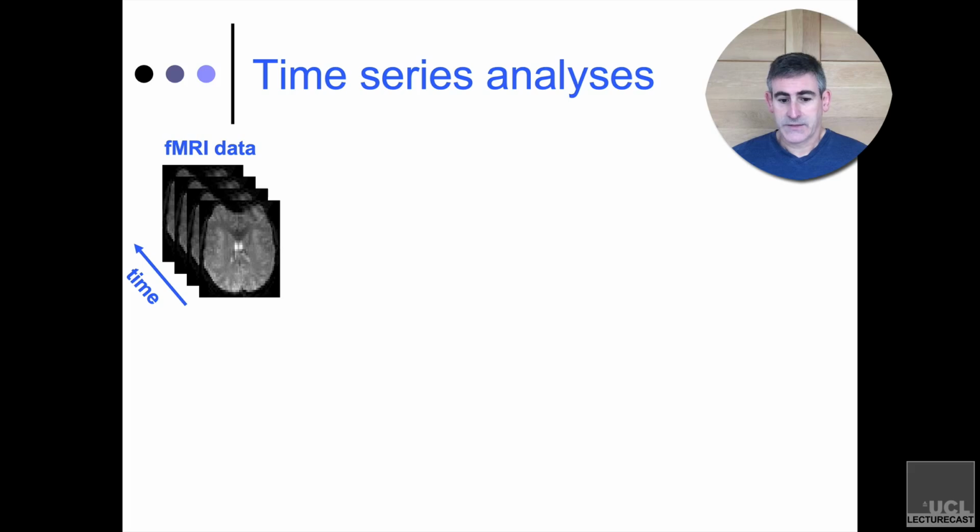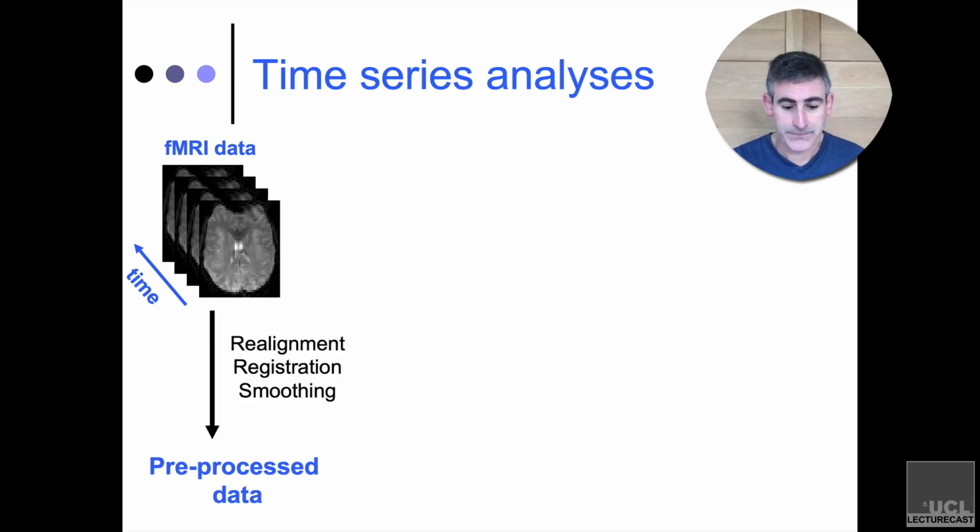The important thing to start with is that the data that we've acquired during an fMRI series is a time series data set. That is to say, we kept acquiring volumes time after time, every repetition time, right? So we didn't just acquire one and then something else at a random time. There's a fixed interval and it's constant. That's what the data that we're looking at are.